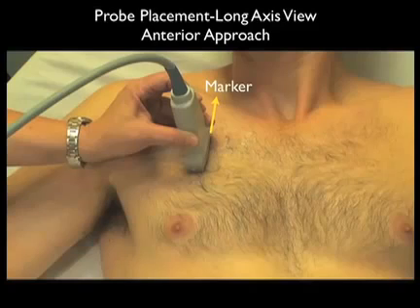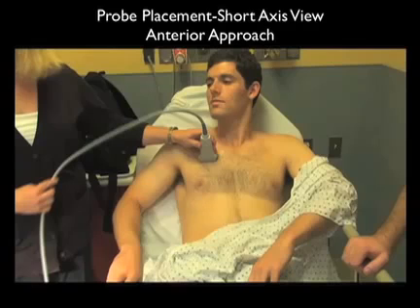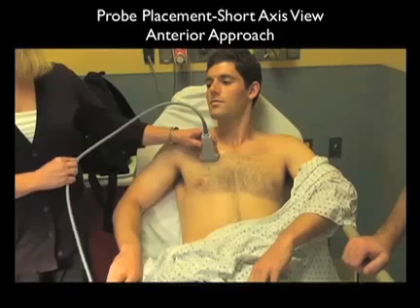Note we're looking in a long axis configuration between the ribs with a marker dot oriented superiorly towards the patient's head. Once we've identified both the ribs and the pleura, we can swivel the probe into the short axis configuration to further look at the pleura and to detect pneumothorax.